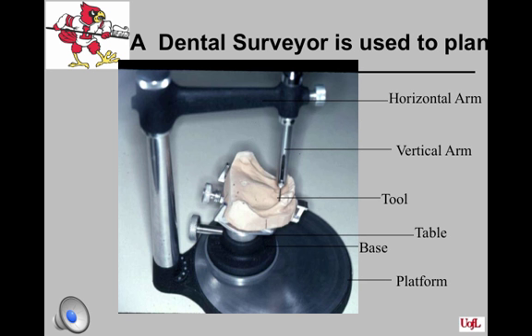As the clasp assembly is seated, the direct retainer will be active. It will return to a passive state when it is completely seated past the height of contour. This motion places the retentive terminal 1/3 of the direct retainer into an undercut relative to the path of insertion.